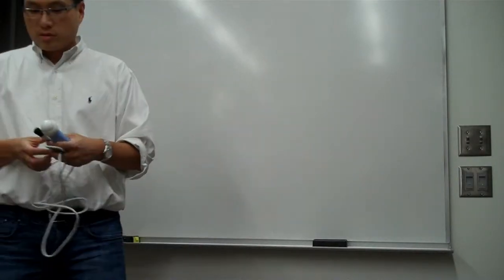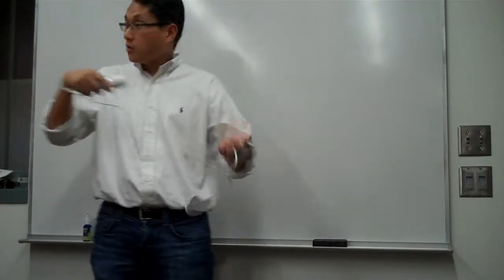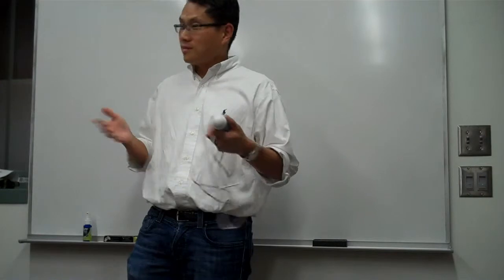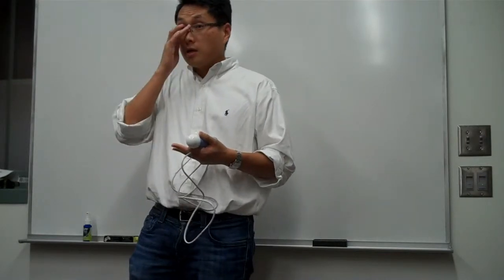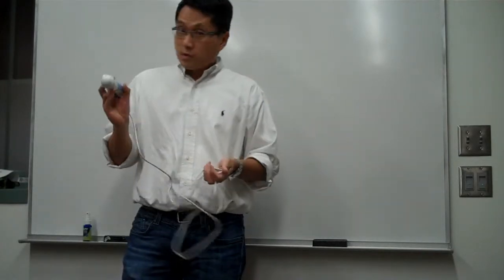Okay, so I'm now going to describe what the problem is. Ultrasound is very useful in scanning the inside of our body, right? If we could open the skin and see what's going on, we wouldn't need to get ultrasounds, MRIs, things like that. But what's very difficult about ultrasound is that this is an ultrasound probe.